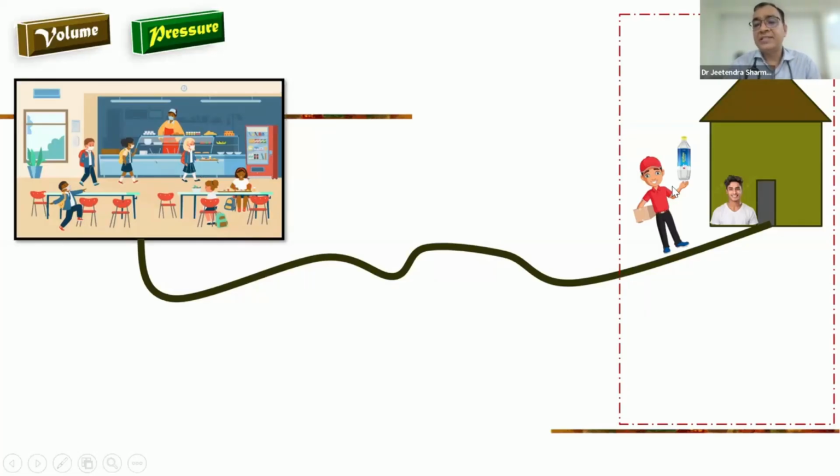There is no participation of this delivery boy. This is called controlled ventilation. That means controlled ventilation is purely time triggered. Who is actually giving the command? They will deliver at 6 a.m., 2 p.m., 10 p.m. So this is called control.